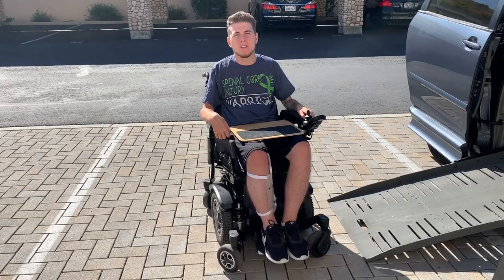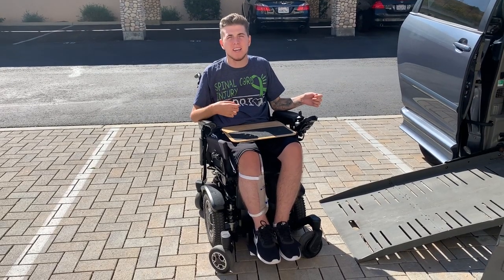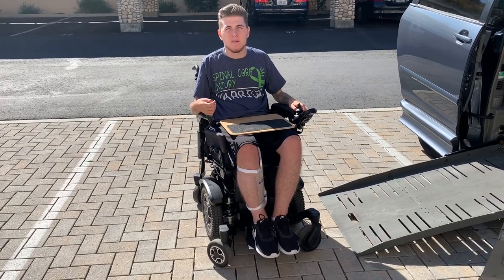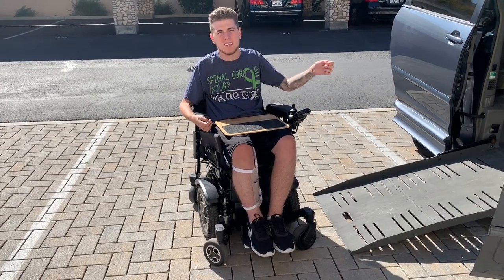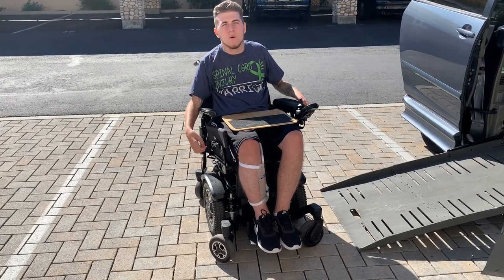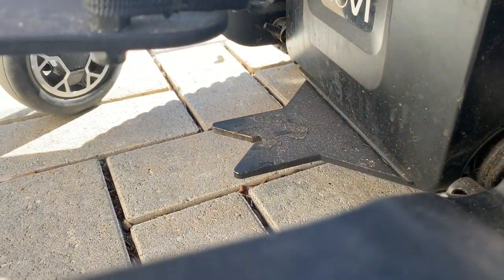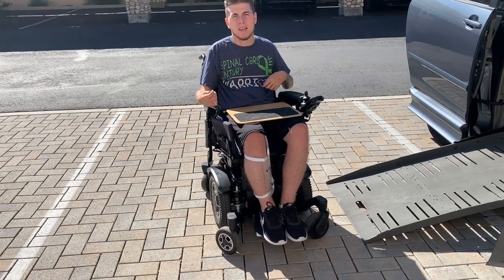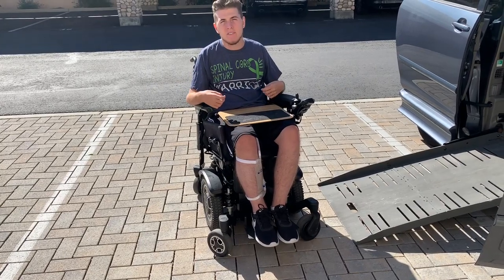Hey guys, Zach here back with another video. This one's gonna be really short, but I wanted to show you this new lockdown device that I got installed in my car about a week ago. It's called an Easy Lock. Basically, it's a device that is locked into the ground on my passenger side, and I got installed a piece that goes underneath my wheelchair so I can roll into it and it automatically locks me down.